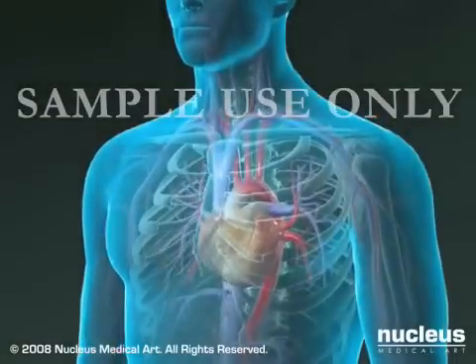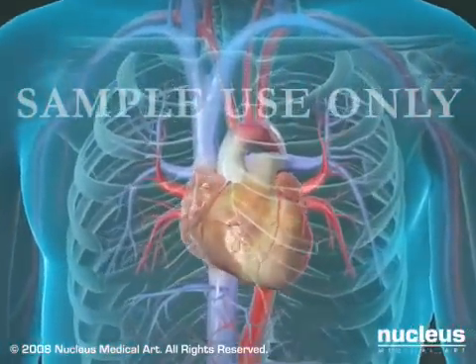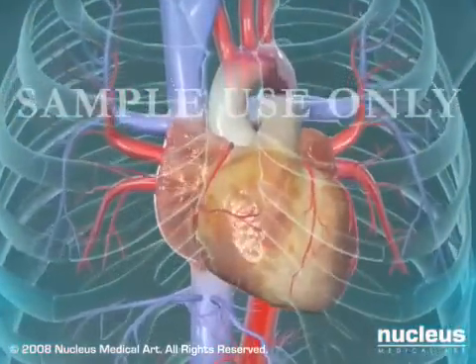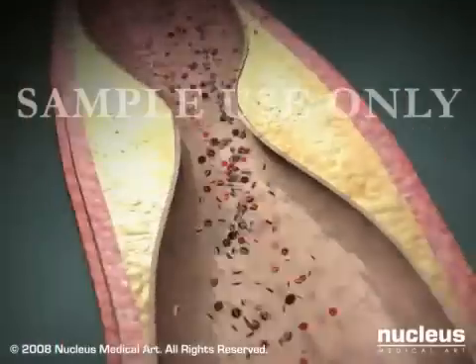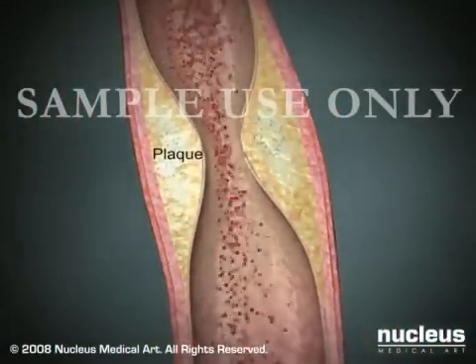Coronary angioplasty, also called percutaneous transluminal coronary angioplasty, or balloon angioplasty, is designed to restore the flow of blood through coronary arteries narrowed or clogged by atherosclerotic plaques or blood clots.